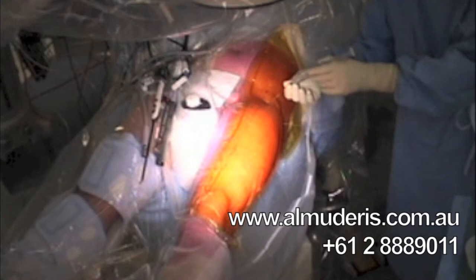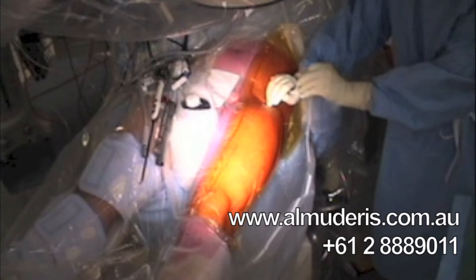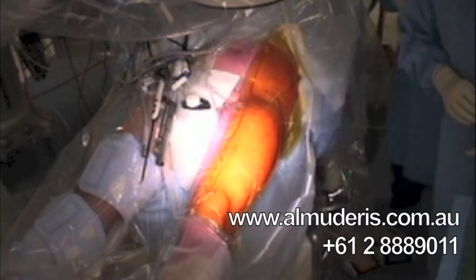I inject local anesthetics with adrenaline. And you can see there is backflow. Second guide wire is inserted again. Now I have two wires inside the hip joint. Then I make a small stab incision.